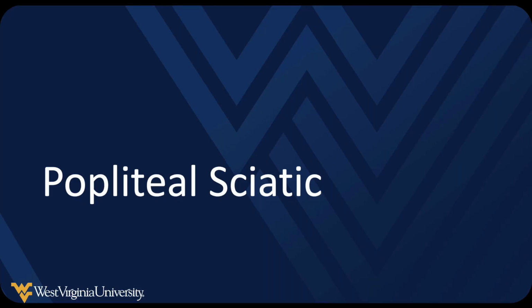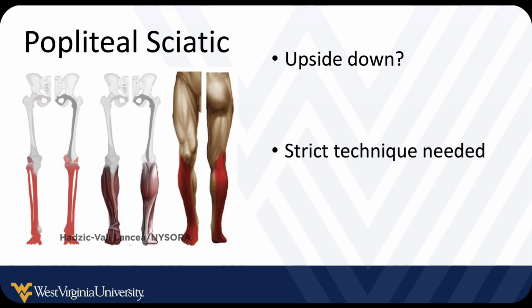Let's go ahead and move on and talk a little bit about the popliteal sciatic. Again, with all these things, once you are good at guiding your needle, you can refresh yourself on the anatomy and the distribution and perform pretty much any of these. So let's take a look at this one. This is the distribution, so more lower leg things. I use this a lot for a bimal or trimal or some of these nasty ankle fractures that we see. These patients hurt a lot.